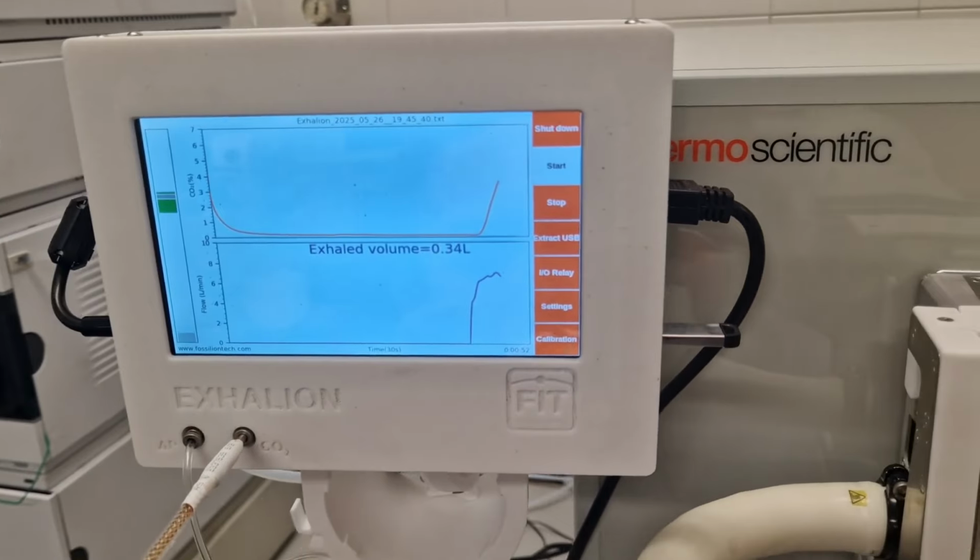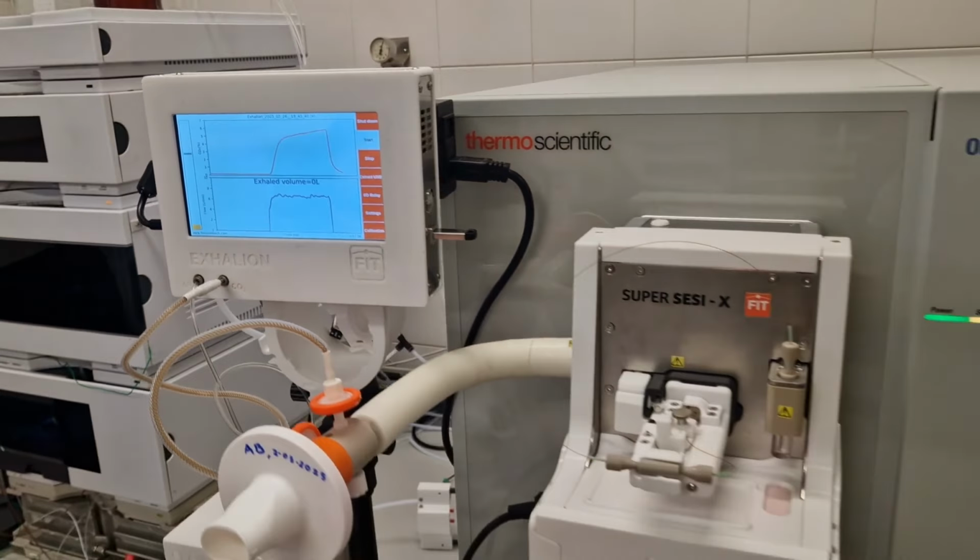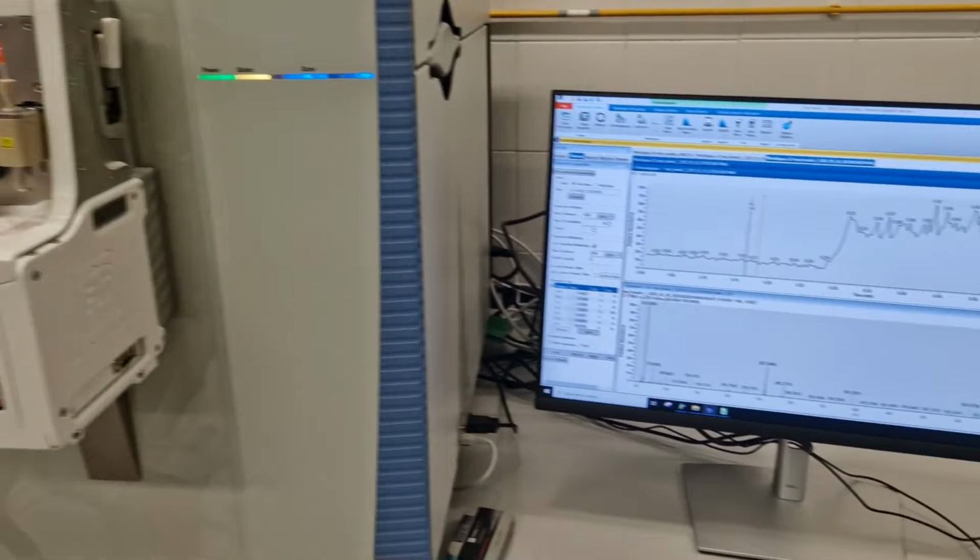Non-invasive, fast, and capable of measuring thousands of molecules in just a few seconds, breath analysis opens possibilities for early screening, non-invasive diagnosis, drug monitoring, you name it. Police use breath tests to detect alcohol every day. Doctors, not so much. Why?